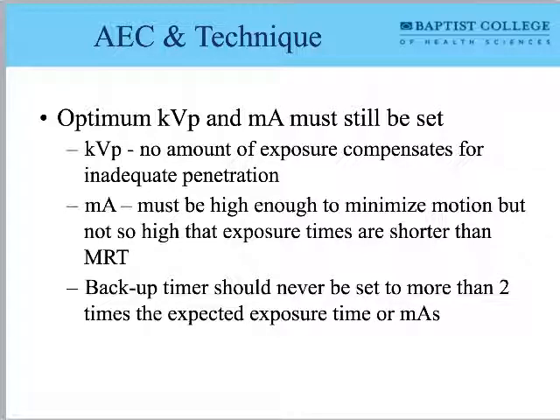When the x-rays enter that ion chamber, they ionize gas inside that chamber. Very similar to a Geiger counter, those gas molecules, since they've been ionized, are attracted to a negative receptor. So we count the number that have been ionized, and that number is stored in a capacitor. A capacitor just stores electrical charge.